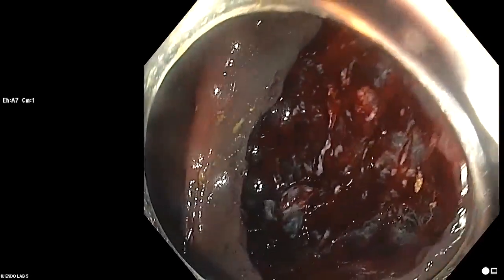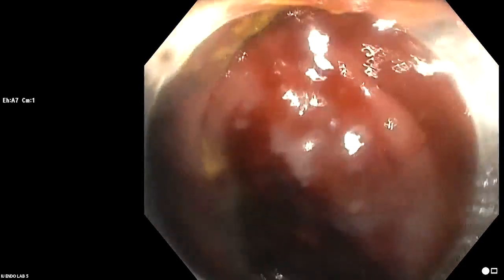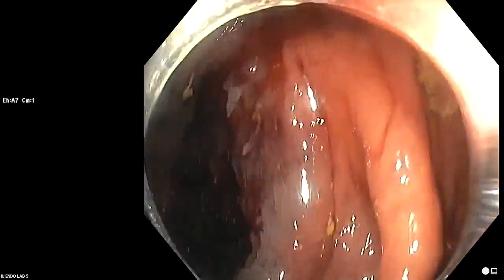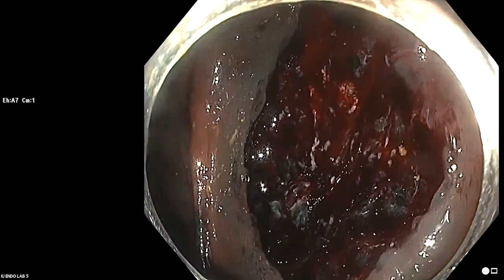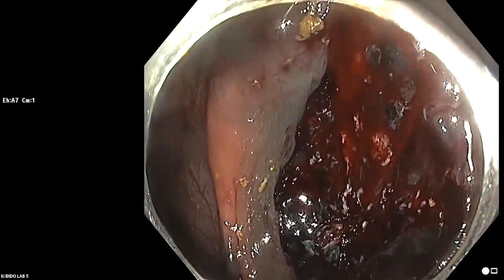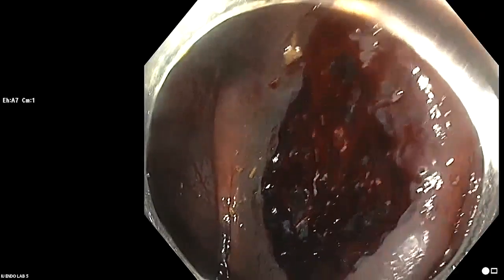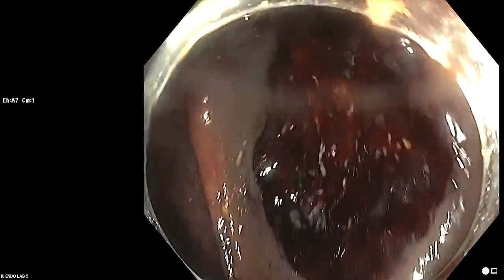As I said, I think the risk of cancer developing from a large SSL is actually quite low, for reasons that I said. I typically, if there are any glands that have survived here, I would come back in a year to look at this rather than 6 months, to give them a chance to be endoscopically visible so that you can target your treatment. And that's not really guideline based.